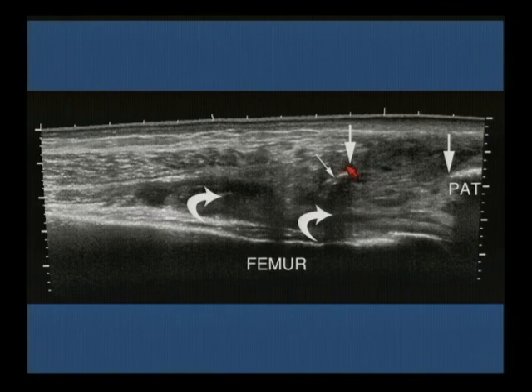The quadriceps tendon, when it tears, it can tear in variable extent transversely. Often it'll tear completely, just all the way across. Sometimes only a small amount of it tears transversely. The general rule is if more than 50% of the quadriceps tendon is torn in the transverse plane, the surgeon will repair the tendon. Sometimes even less than that, the surgeon will repair the tendon. Most tears we see go to surgical repair.